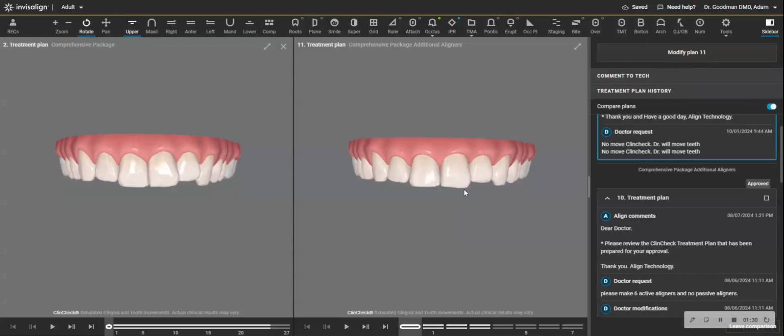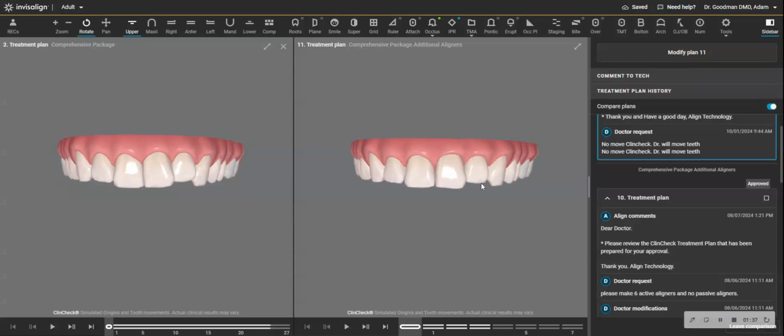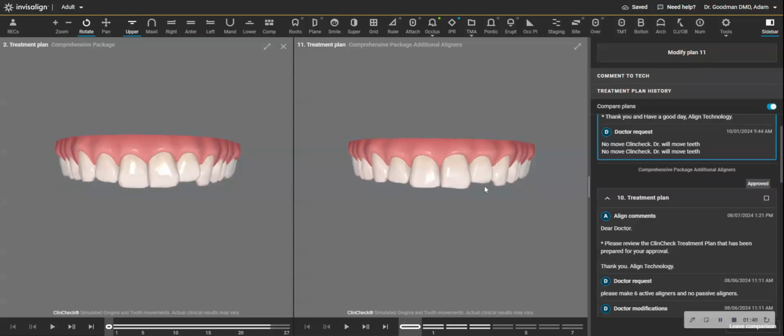One other thing I want to tell you on this case, this also is very common. You see how this tooth looks shorter than these other two. In the most perfect aesthetic mouth, you would maybe see about a 0.5 millimeter disparity in height. But here we have more like a 1.5, almost 2 millimeter disparity. Now, you might orthodontically try to bring this tooth down so that you can get it to be more level. But when this patient smiles, it just so happens that this patient's lip line falls right at the line of the gum line, which is good.